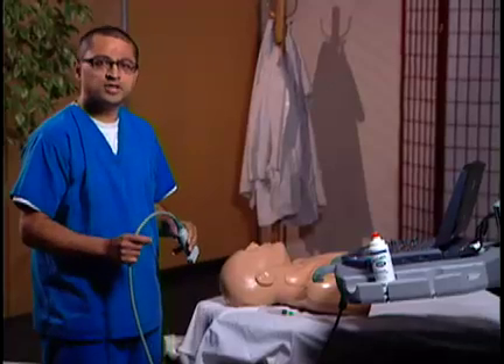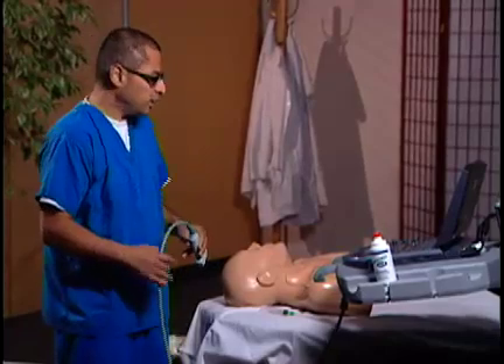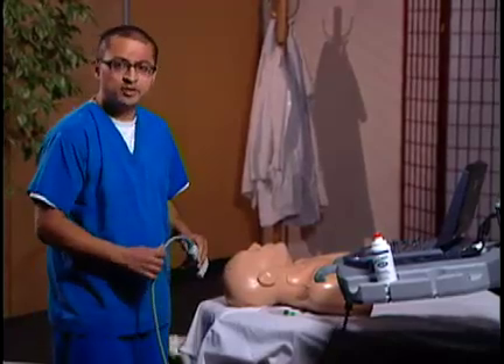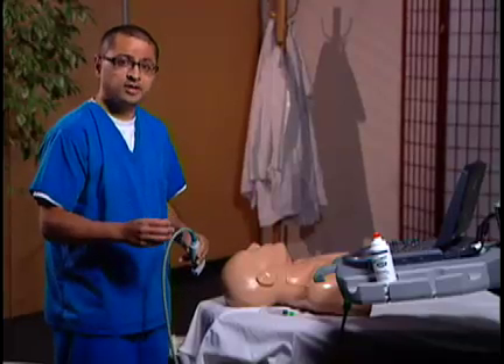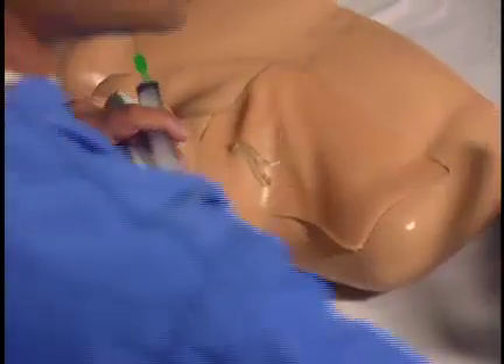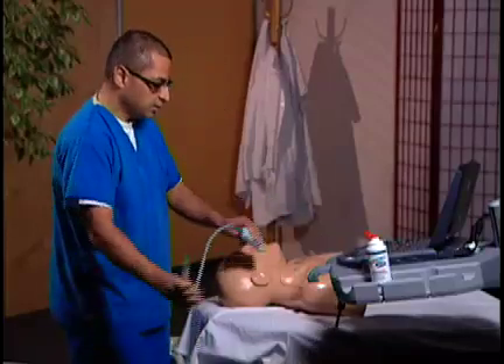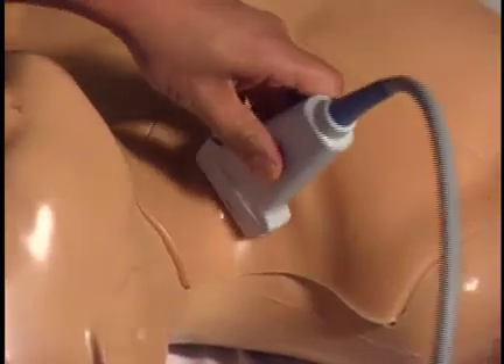I'm going to show you how to use ultrasound to actually guide your needle into the internal jugular vein. As you can see, we have a blue phantom here. We're going to take a look at the vein first with ultrasound, and then I'm going to use the ultrasound transducer to actually guide my needle toward the vein. I'm going to go ahead and place a little bit of gel onto the neck where I expect the jugular vein to lie, and then use my transducer to identify this vein.